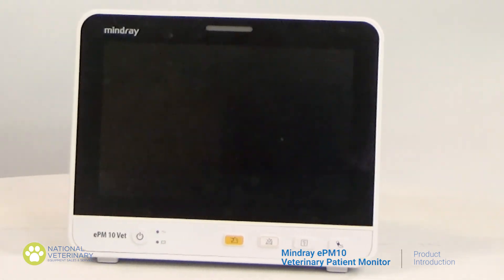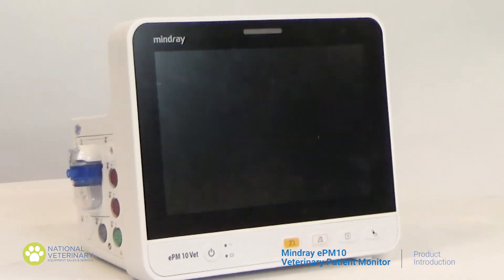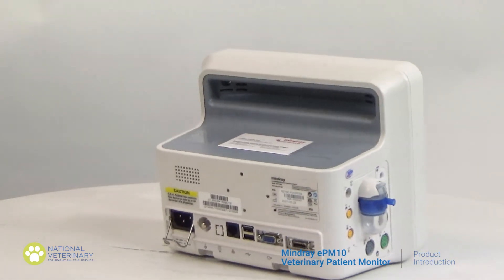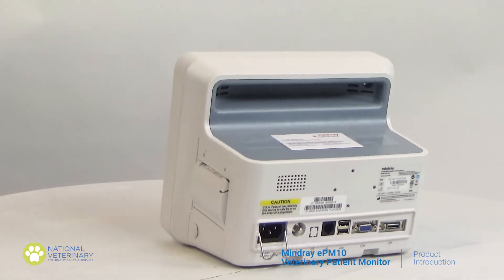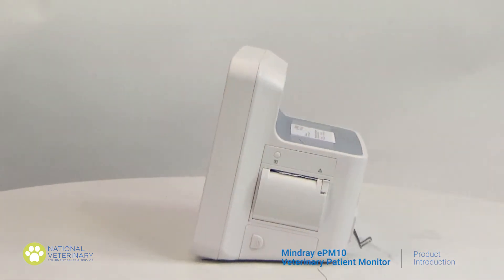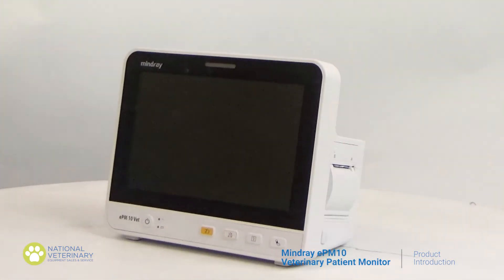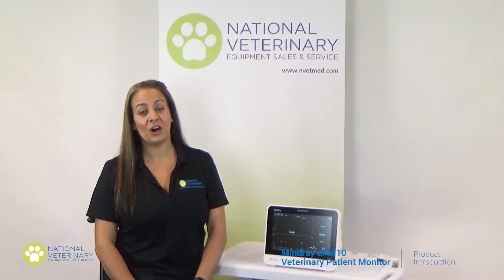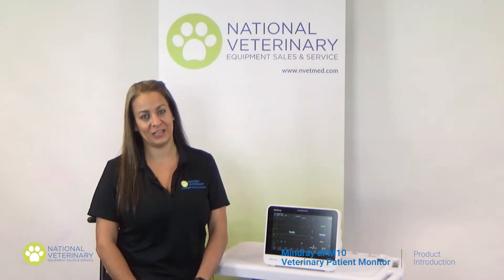The EPM10 focuses on progressive design, making this monitor a convenient and efficient solution to your patient monitoring needs. It has a 10-inch high-definition touchscreen along with gesture controls. It is the very first gesture-controlled veterinary monitor in the world, offering quite the user-friendly interface.